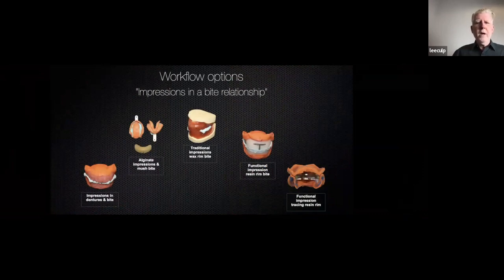So the cool thing about doing a digital denture is you can come in any way you want to. There's basically 3 different ways to do a denture. You've got an immediate denture, and that's easy. I mean, I love doing immediate dentures. And then you have existing dentures. And this is what John and I have been doing on his existing dentures. And he can explain it a little bit more also.